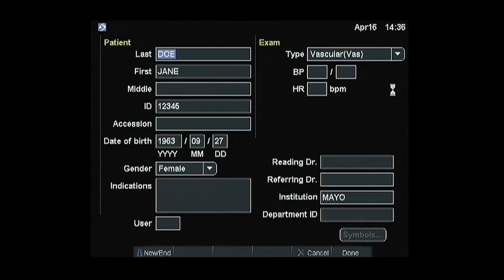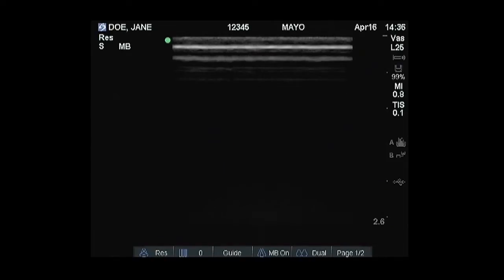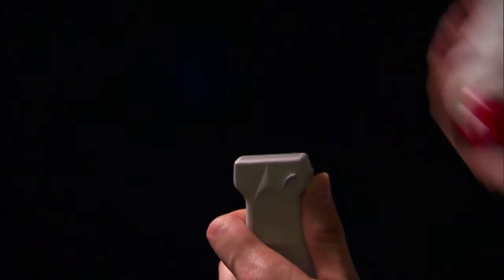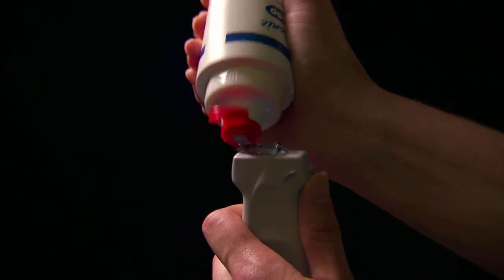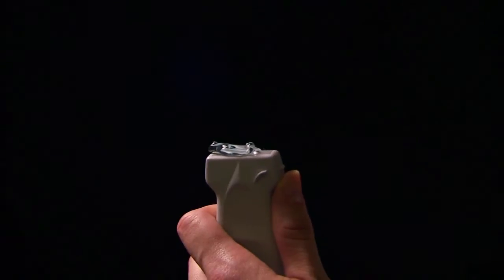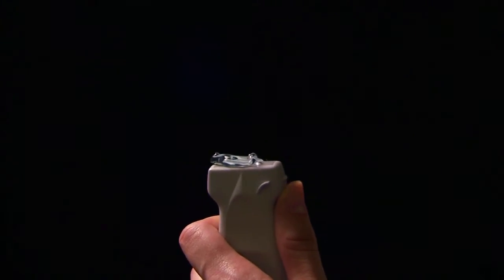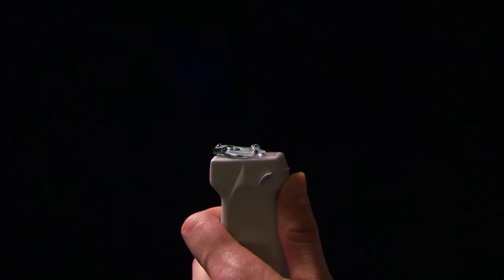The exam type symbol will now indicate the exam type that has been selected. Use a coupling gel to remove any air between the transducer face and the skin surface.